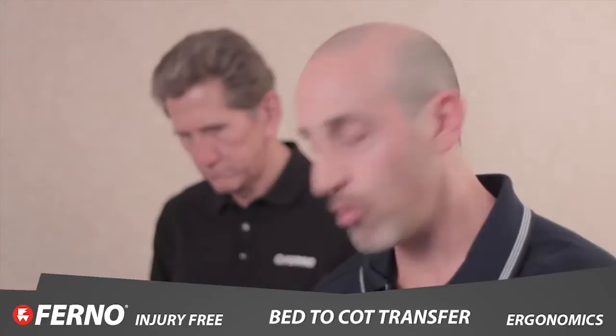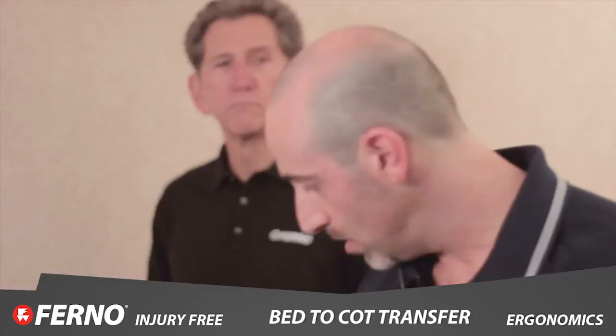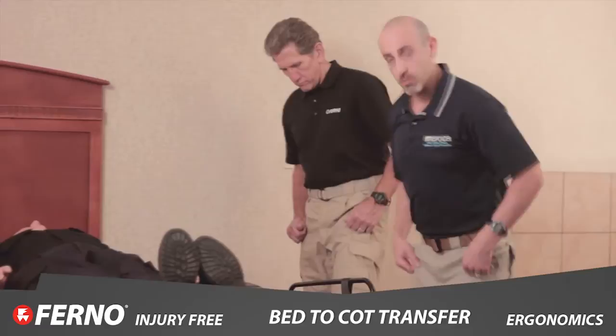So what do you do? Roll the patient to their side, get the tarp or sheet underneath them. They're at the edge of the bed, stretcher's ready to go in your traditional fashion.